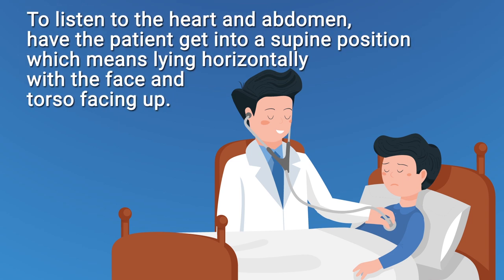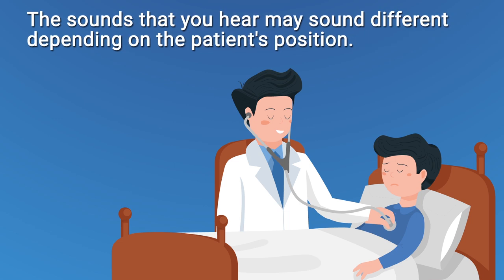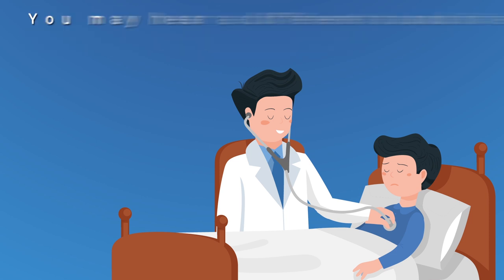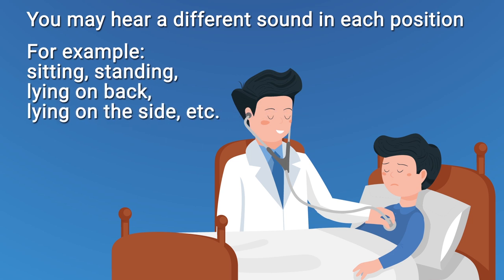To listen to the heart and abdomen, have the patient get into the supine position — lying horizontally with the face and torso facing up. Keep in mind that the sounds you hear may sound different depending on the patient's position.